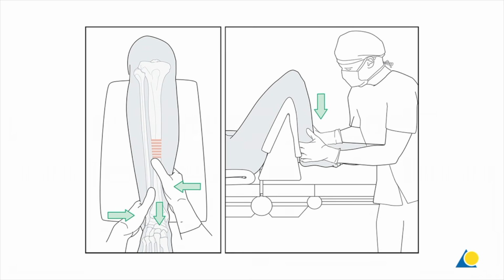Depending on the patient positioning and type of OR table, 1 or 2 people may be required to perform manual traction. The illustration shows a triangular radiolucent supporting frame with padding over the top placed proximal to the popliteal fossa. It provides counter traction when the fracture is lengthened with distal traction. For patients positioned on a radiolucent table without knee support, 1 person holds the leg and the other pulls the leg distally. The reduction is controlled during traction by palpating the tibial crest and the anteromedial surface.